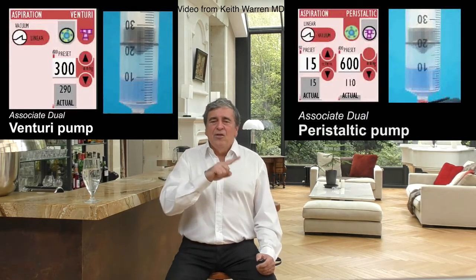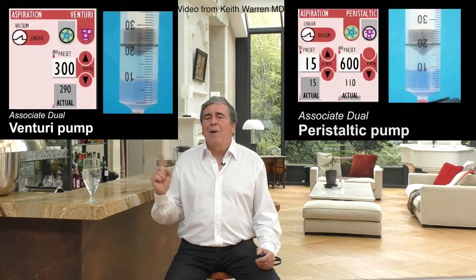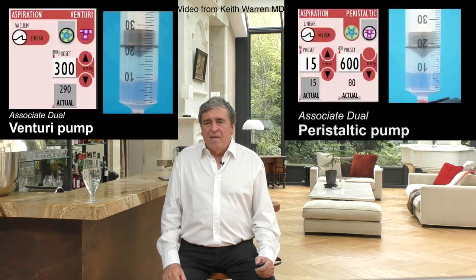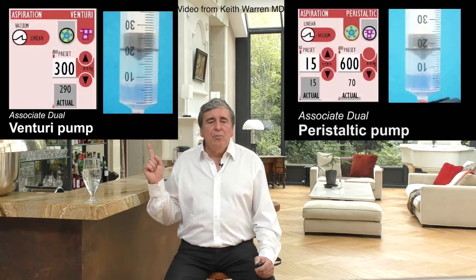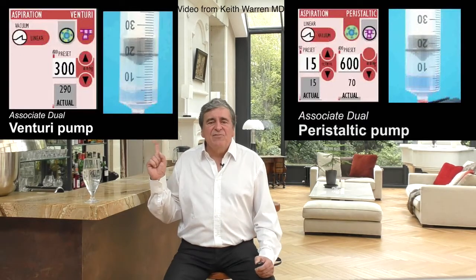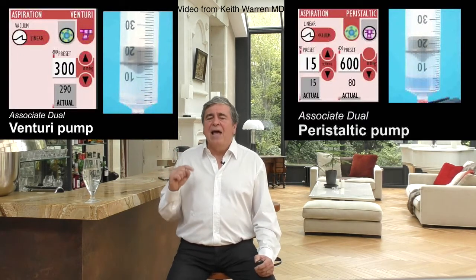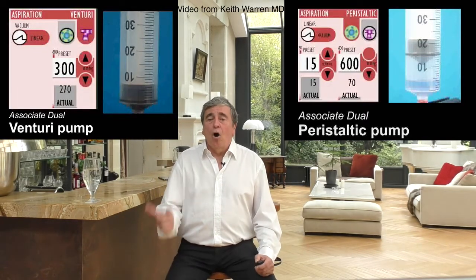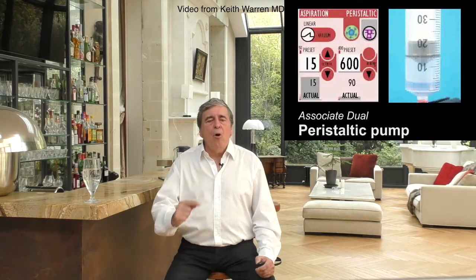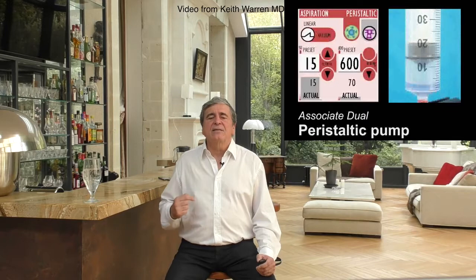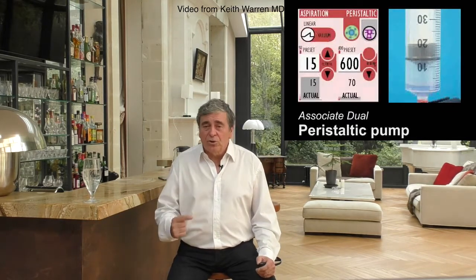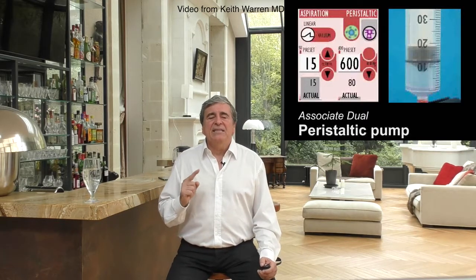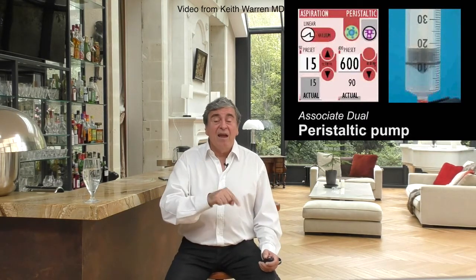The difference in behavior is clearly visible. At the beginning, the two pumps will suck the honey at about the same speed in about 40 seconds. Then, on the left side, when the venturi pump passes through the water, the speed of aspiration accelerates and becomes uncontrollable in the air. On the contrary, on the right, the peristaltic pump will continue to regularly suck at the same speed in the water and even in the air, which explains why it is so precious in fluid-air and especially air-fluid exchange.